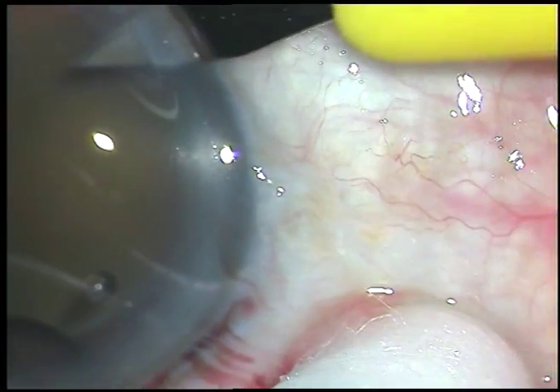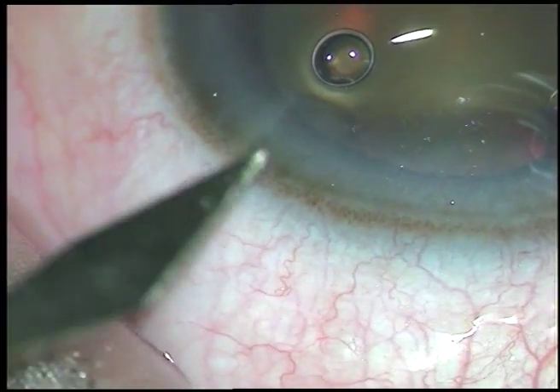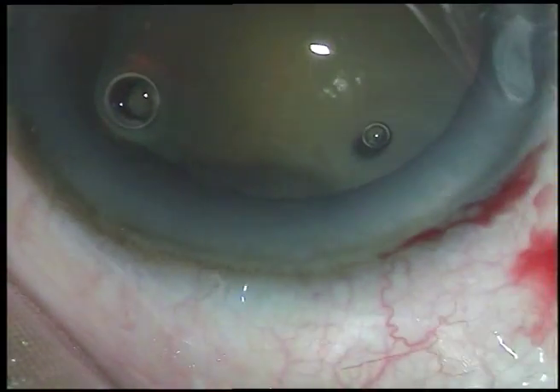Now this is a side port on the right side of the main incision, and this is another side port on the left side of the main incision.